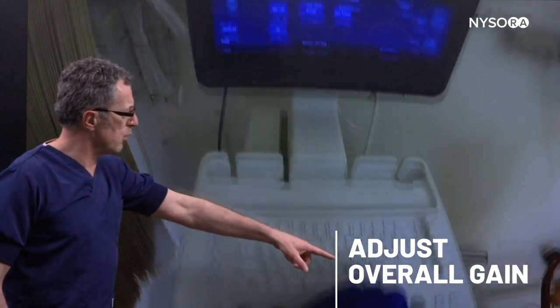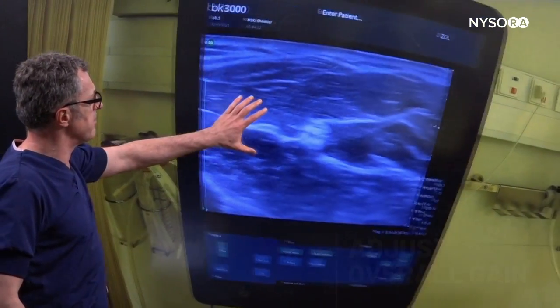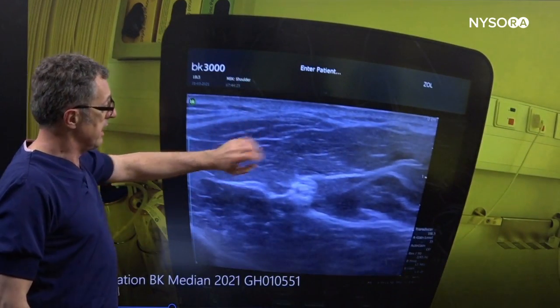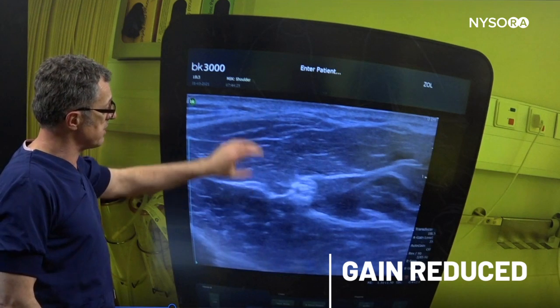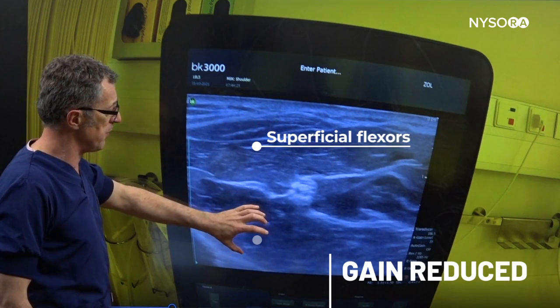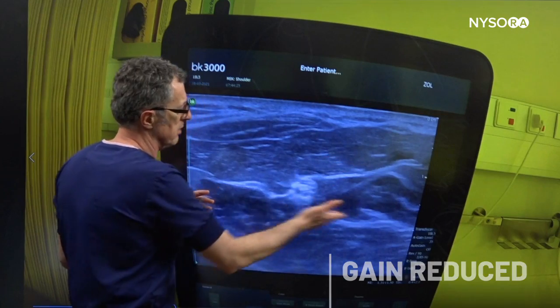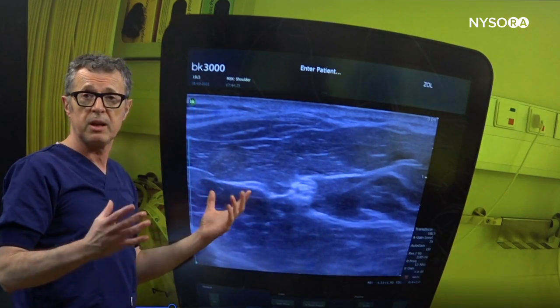The first thing we're going to do is adjust the overall gain. As we go back to that image we can see the overall gain has gotten a little bit better. Now I can actually see the structure of these muscles — the superficial flexors and the deep flexors — and I'm starting to see a bit better the fascia sheets that envelop the median nerve.